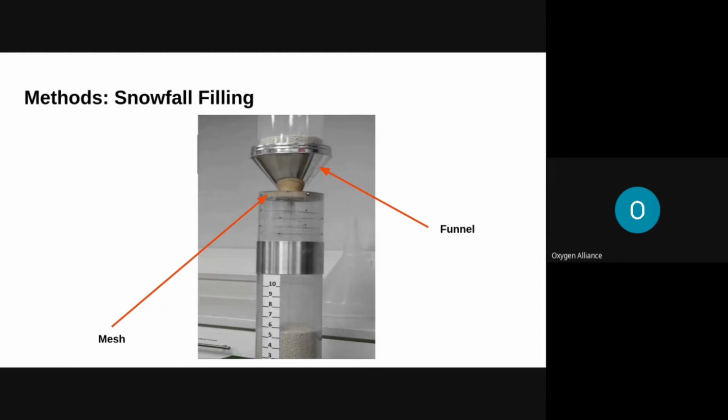This is a very cheap technique, and the theory behind it is that the mesh randomizes the flow of the granules, ensuring each adsorption granule has minimum energy and is able to find an optimum position within the sieve bed, so it stays without leaving any spaces. During this process, the sieve bed needs to remain flat, 90 degrees to the ground, and it has to be still, because if you tilt it, the zeolite won't sit properly. This method is slower and requires a lot of patience and control.